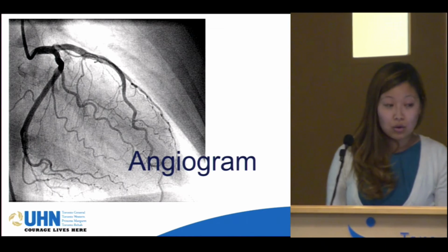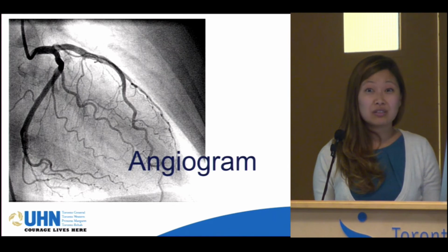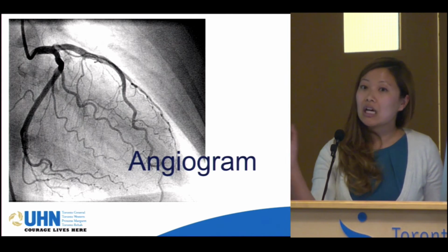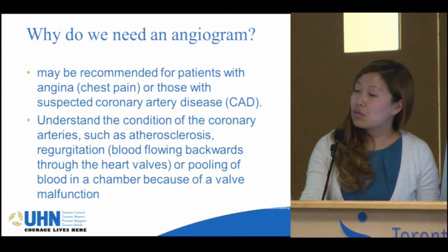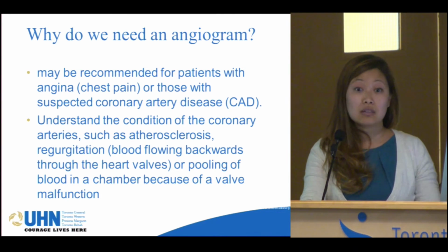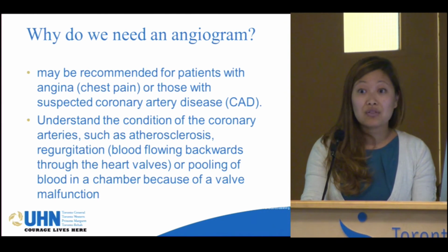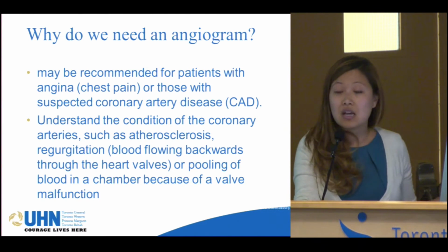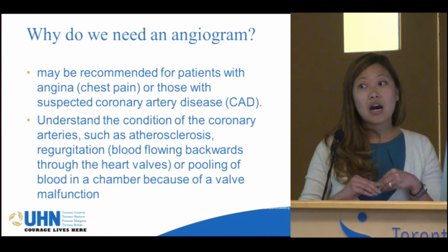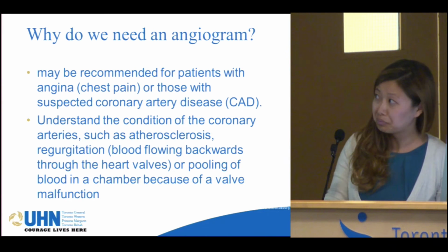All right. So I'm going to be talking about the angiogram with you folks. Basically, who here has had one? Yeah, quite a few of you have had one. Basically, we're looking at the coronary arteries of the heart, and why do we need one? Why did the doctor send you guys for one? It's mainly because of all the symptoms that all of my other colleagues have mentioned. So things like chest pain is a very common one, and they've done all these tests, and they can't figure out what's going on. So as Rob mentioned, we want to get a little more specific. Some people call this the gold standard, but it comes at a risk, which I'll talk about shortly.